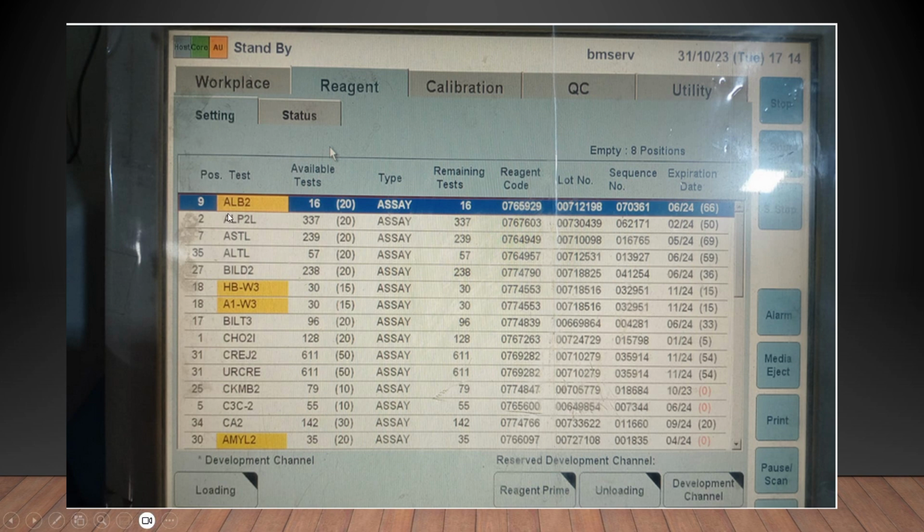Okay, see, albumin, alkaline phosphatase, LFT, RFT, all these types of reagents, we will always have 1 or 2 reagents as a backup, because we can't order them every now and then. So we will always have backup. So many times what happens, when this lot number reagent is already present, you should always add that particular lot number only.